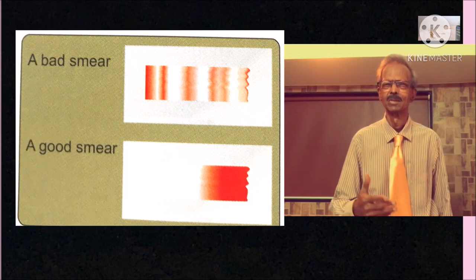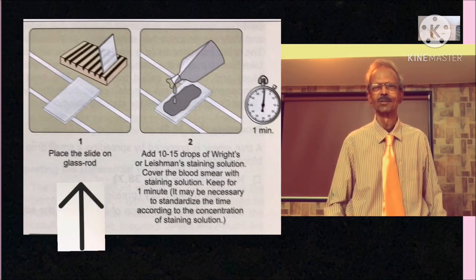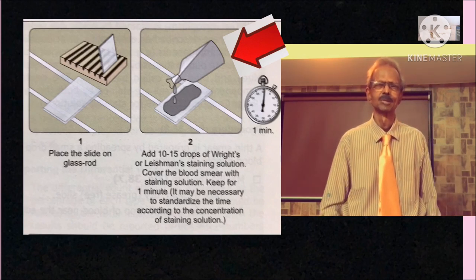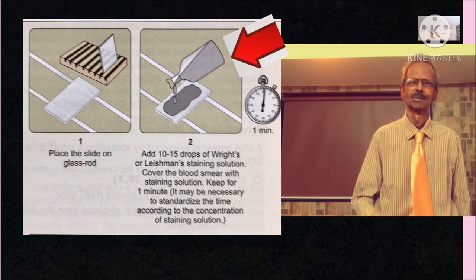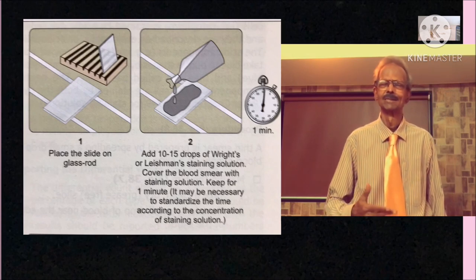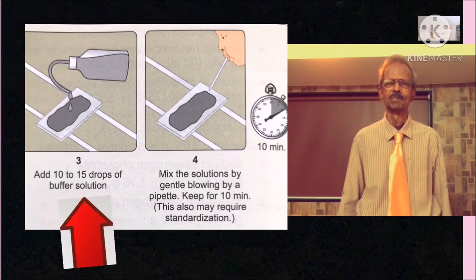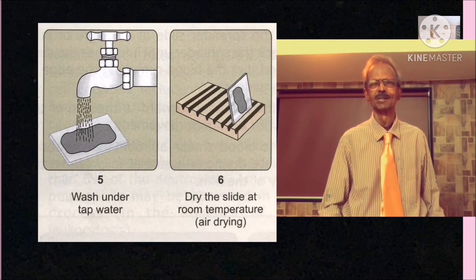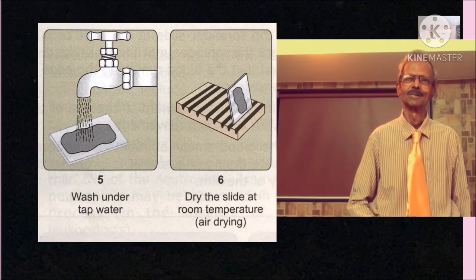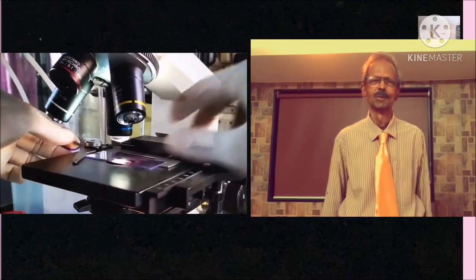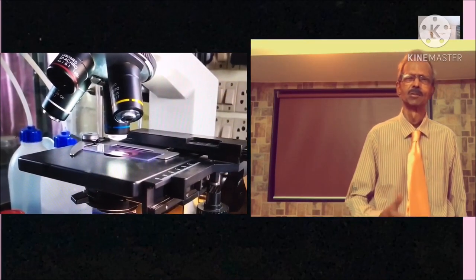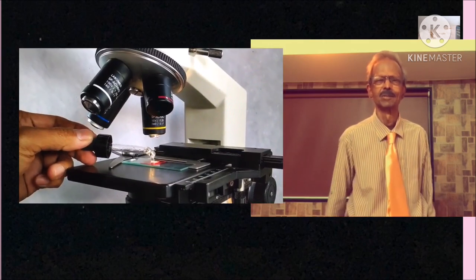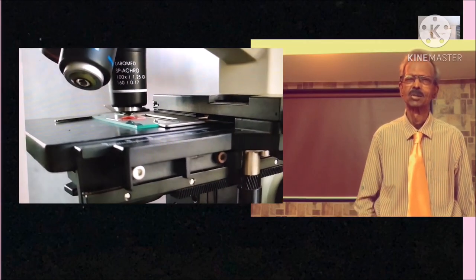Next, dry the blood smear at room temperature and make identification mark on it using a pencil. Next, then place the dried blood smear on the glass rods and cover it with either Wright's staining solution or Leishman solution and keep for about 1 minute. Then add equal number of drops of phosphate buffer and mix by gentle blowing and keep for 10 minutes. Next, wash the stained slide by using tap water and dry the stained blood smear at room temperature.